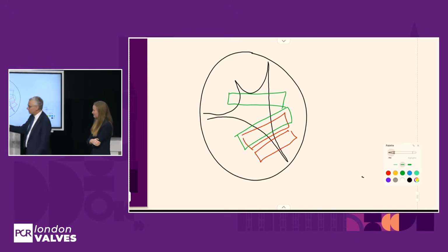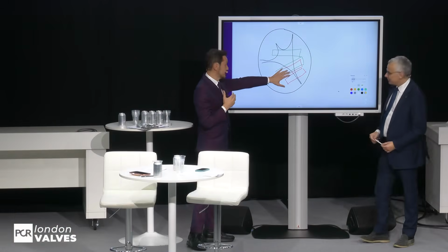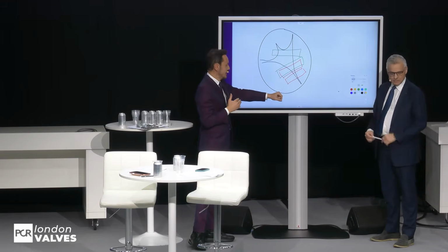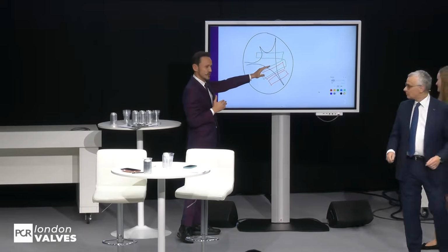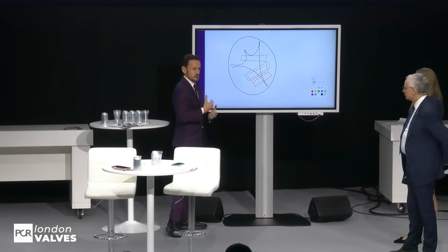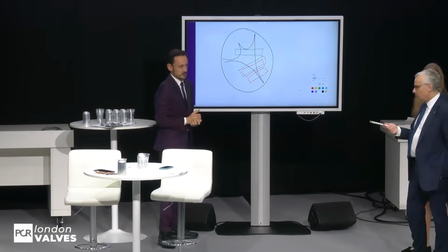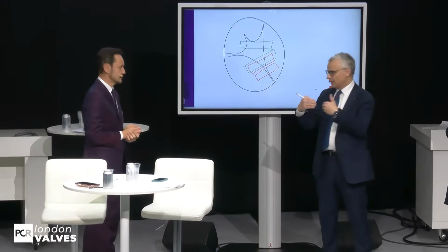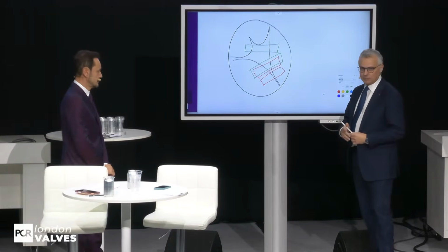What about you? I would probably, just to say something different, start anteroseptally, as central as possible, if the gap allows me not to stay really close to the commissure. Then, depending on how the residual jet is, I would decide whether to put a second one parallel anteroseptally, which would probably be my favorite strategy, or rather go for the clover technique. Yeah, probably this is a smart idea because of the coaptation gap, which is large. So it's good to start anteroseptal to bring the gap forward.